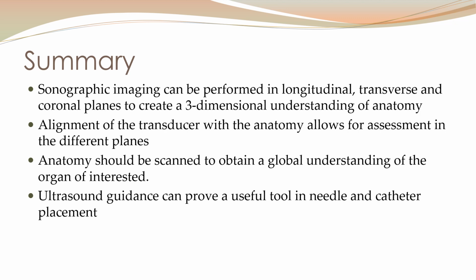In summary, sonographic imaging can be performed in longitudinal, transverse, and coronal planes to create three-dimensional understanding of anatomy. Alignment of the transducer with anatomy allows for assessment in the different planes. Lots of times the plane of our transducer is not going to be long or transverse to the patient's body, but it will be long or transverse to the patient's organ of interest.